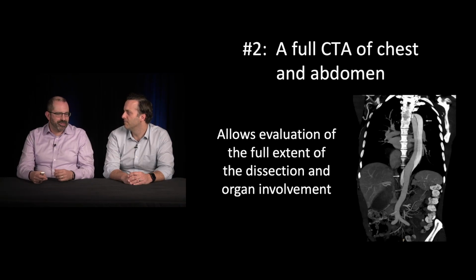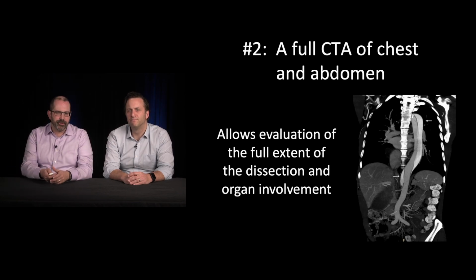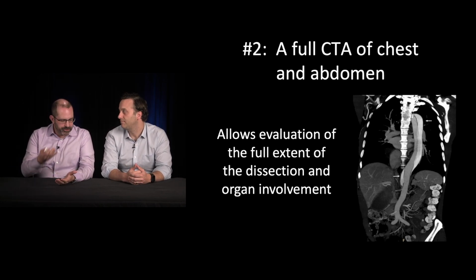It's fascinating to watch them plan out what their approach is going to be. Where are they going to be able to get bypass points and stuff? So that's why we do the full CTA all the way down.